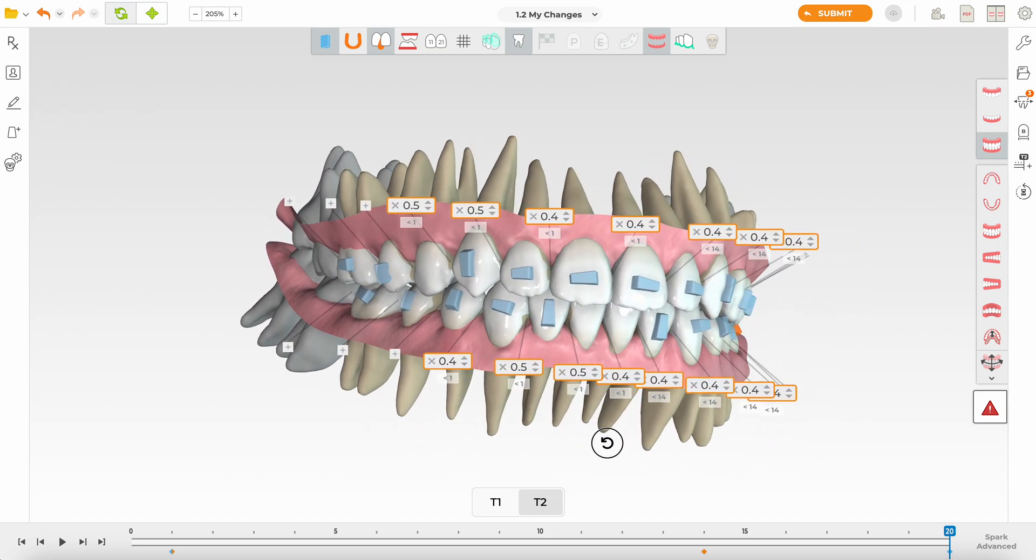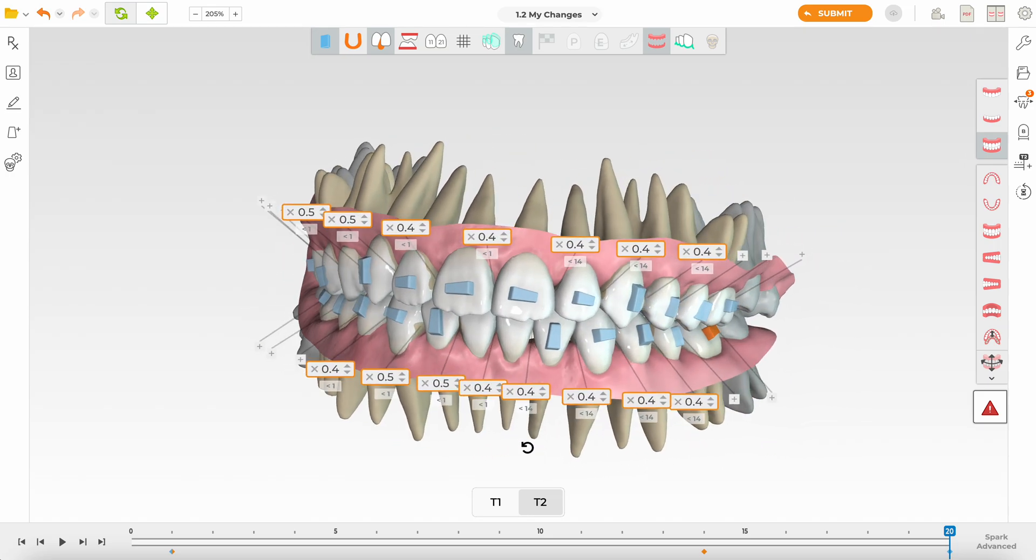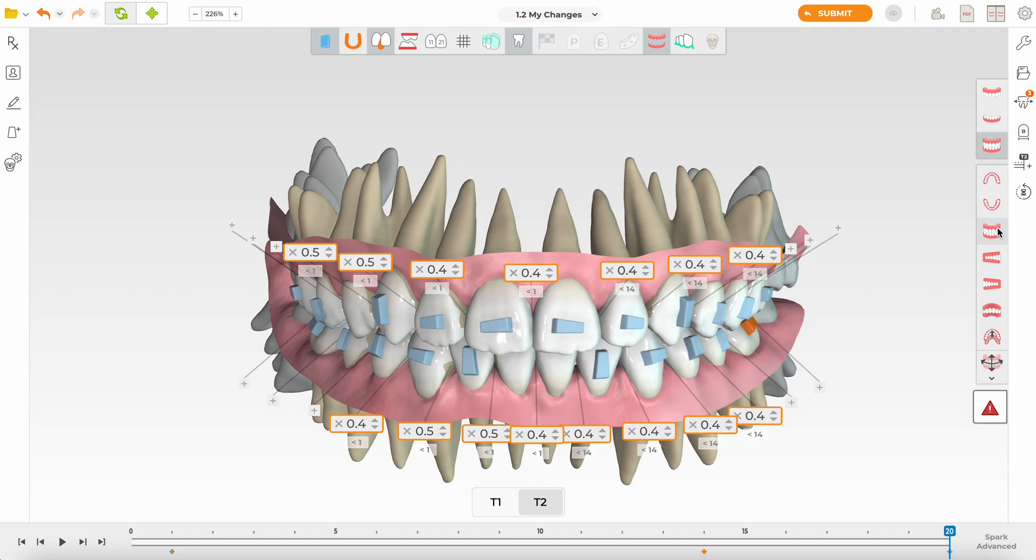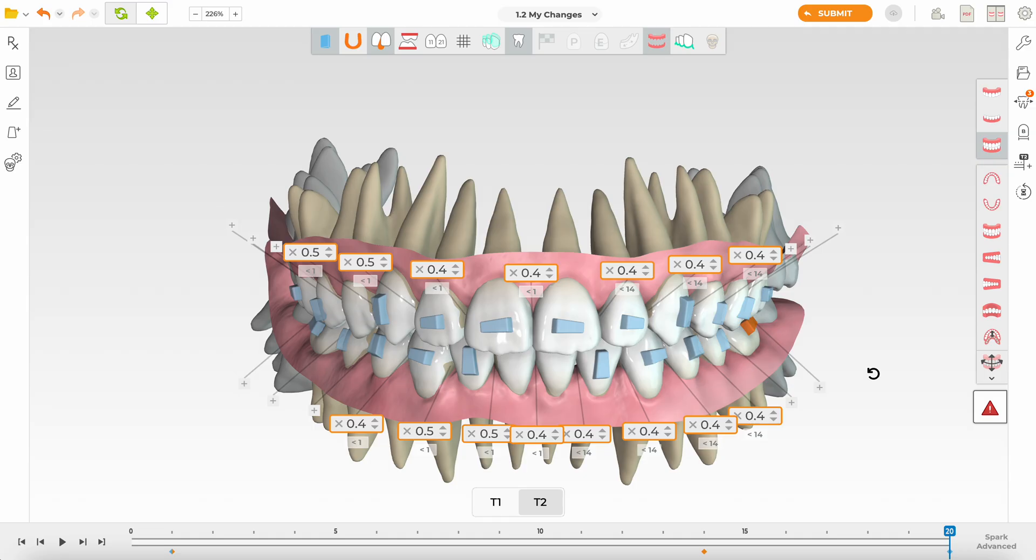So straight away in the first instance I'm going to double the number of aligners. I'm going to reduce the velocity per aligner and I'm going to ask for at least 40 aligners in this case for the upper and lower arch. So that's another tip. Always in my first set if Spark or Invisalign are going to show me 20 aligners on many cases I will literally double them.